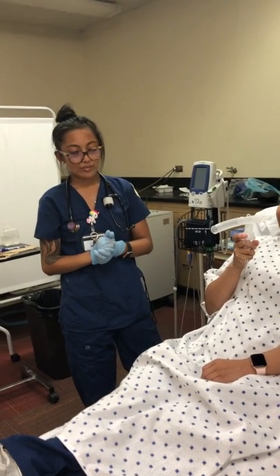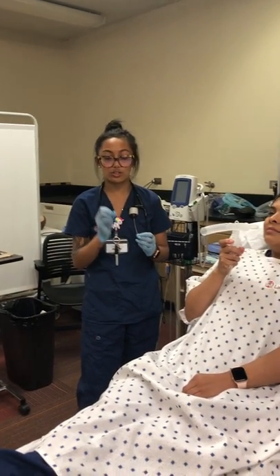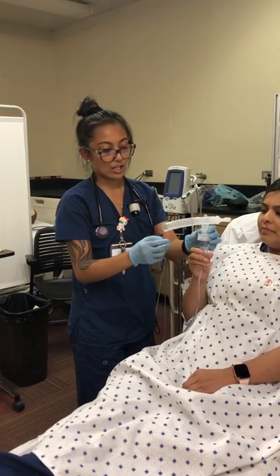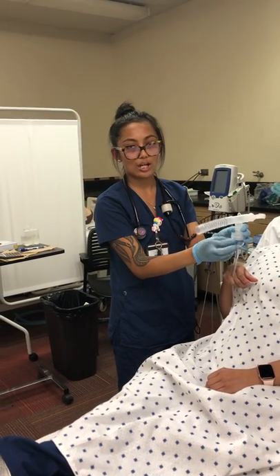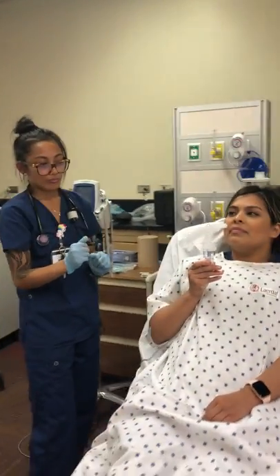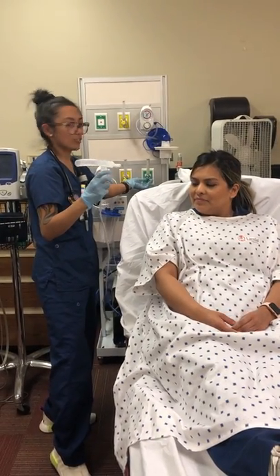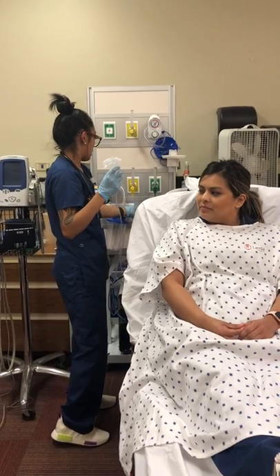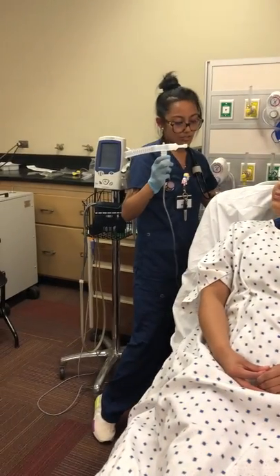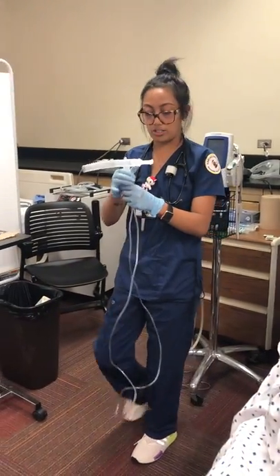We would do this for about 10 minutes. When I start to see that the medication is running out, or I start hearing the medication inside start to sputter around the chamber, I would then hold it close to her so she could still get the medication and just tap it so it would move around. Once it's all finished, I would take the small volume nebulizer off. How do you feel? I'll turn the source off and disconnect it.